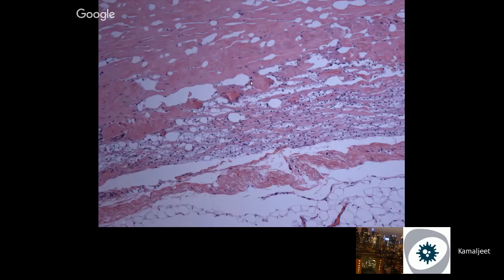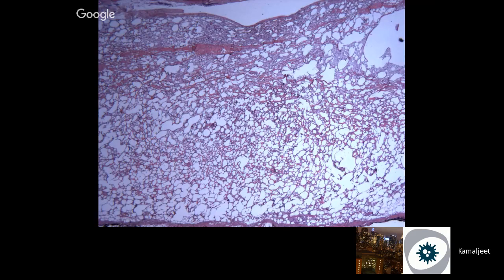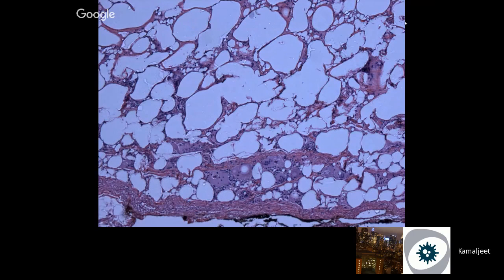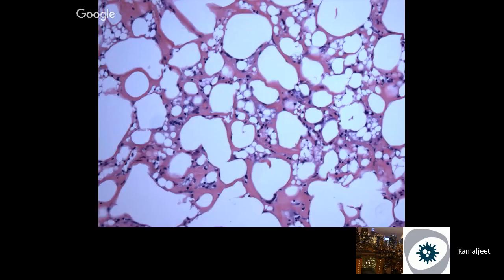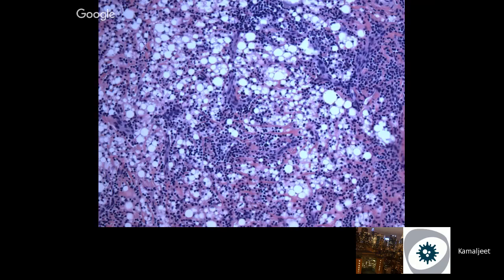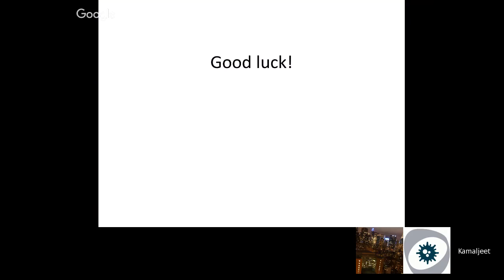Another case where you have the implant and silicone mastopathy. Nice case, an asteroid body in the giant cell. Flip the condenser, you'll see the material. You can have the lymph nodes involved with it too, and there are reports of silicone being present in different parts of the chest. So flip the condenser and see the material. That's it. That's all I could collect.